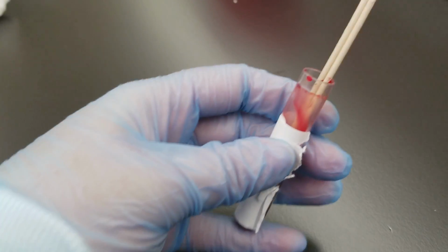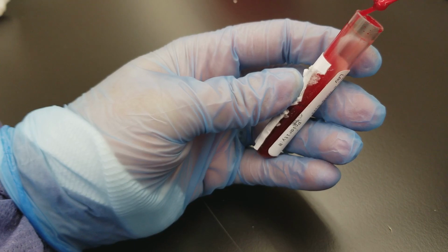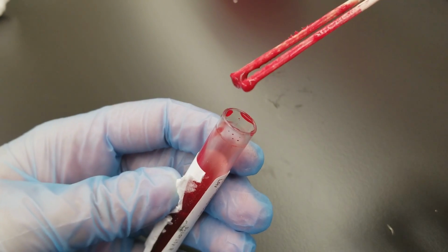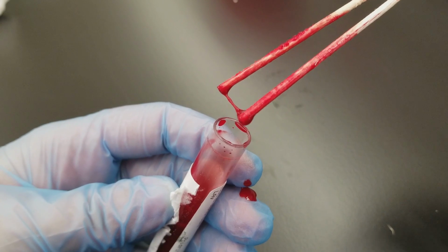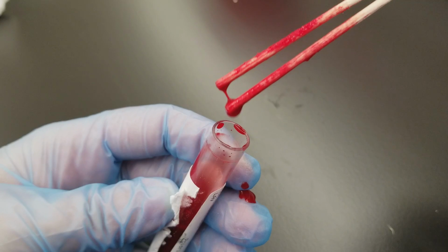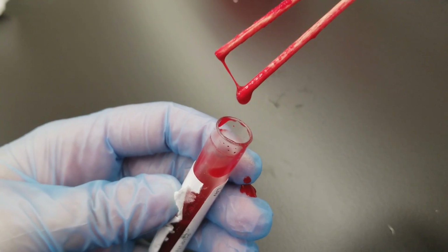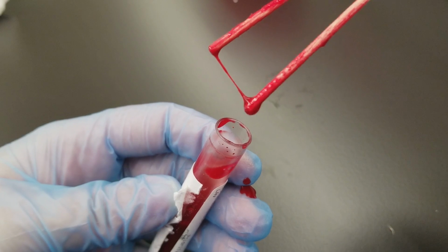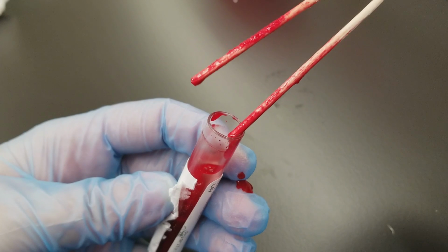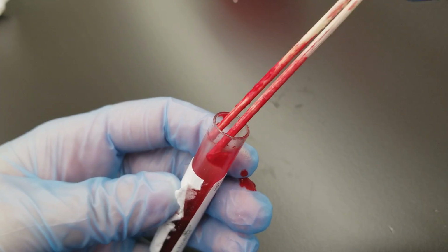And today I just want to show you what a clot looks like in a purple top tube. It can look like so many different things, but see how there's a thick drop and webbing, which I just got all over myself. That is a clot. Those are fibrin strands that are coming together. So if you ever see that, you cannot use that for hematology or blood banking, and you would want to go ahead, call the clinician and cancel that.